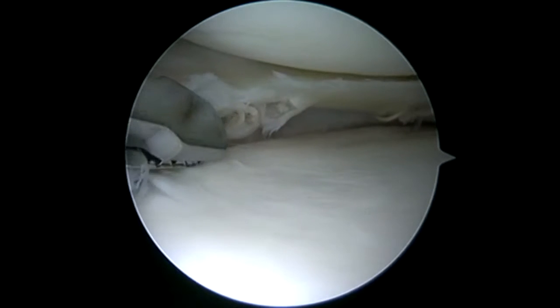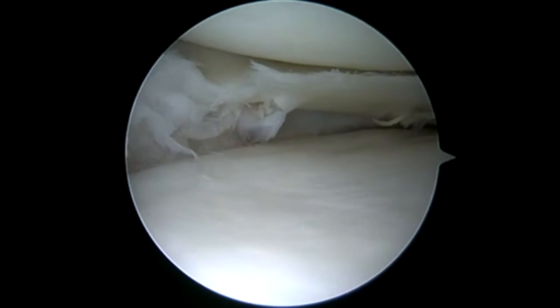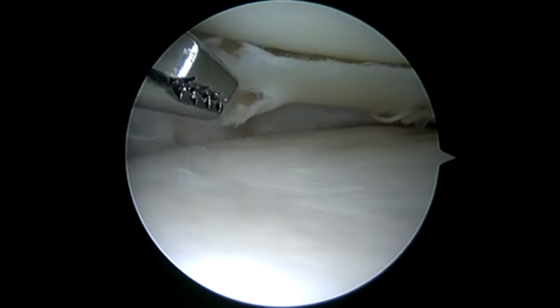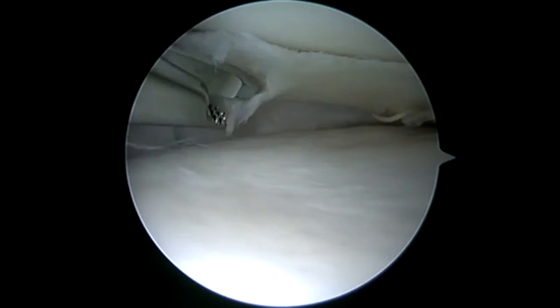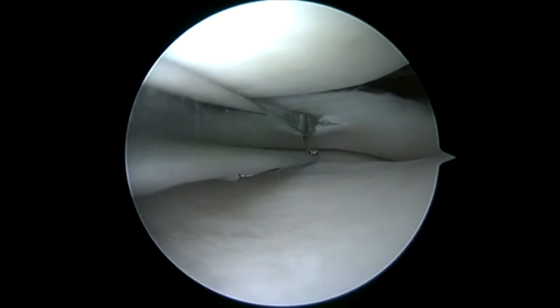Once we get the implants out, we're just going to use our Nova Stitch Plus and repair in standard technique. You can see we retrieved that implant quite easily. We'll pull on these sutures, and you can watch the capsule come at us — that's how you know that implant is actually through the meniscal capsular junction as opposed to within the meniscus itself. You can see meniscus and capsule, and you don't see a good separation between the two, telling us that it's still intact. Here we're tugging on this implant; one of them I know I can get to easily, so I'm going to go ahead and pull pretty hard and just get the implant and the suture in one pull.